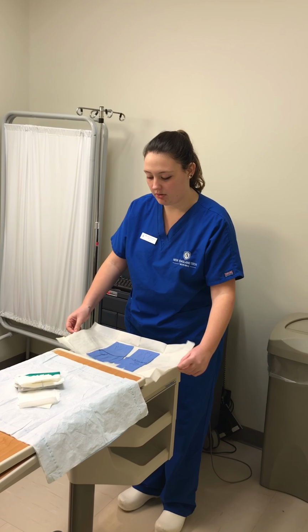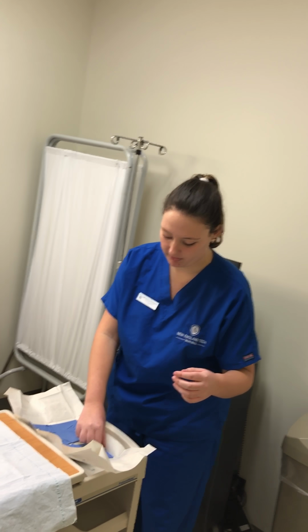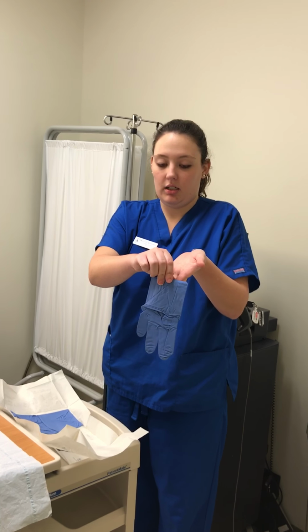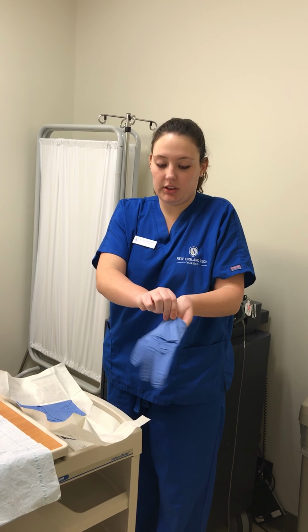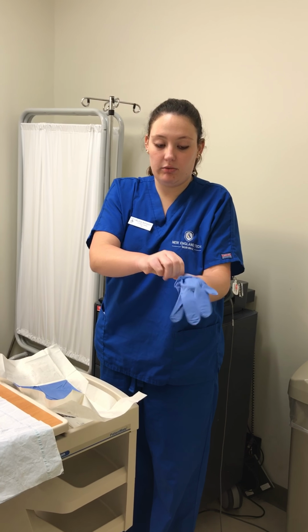Personally, I like to put my sterile gloves on my non-dominant hand first, so that's what I'm going to do. Being very careful to only touch the outside cuff. I'm going to just slide my finger in there, pulling it down round and round.